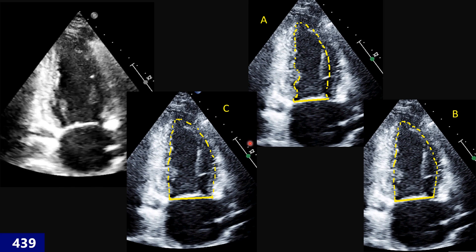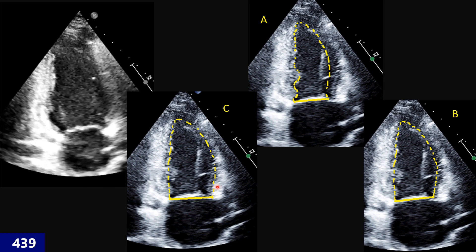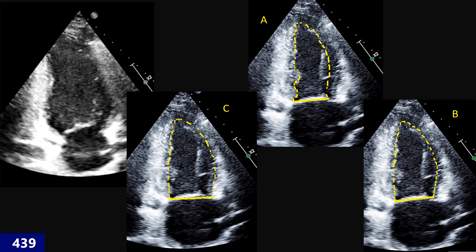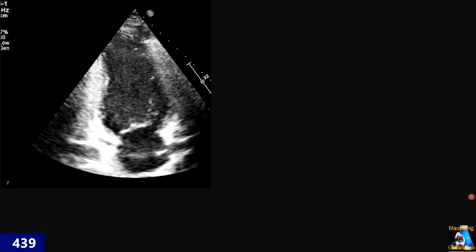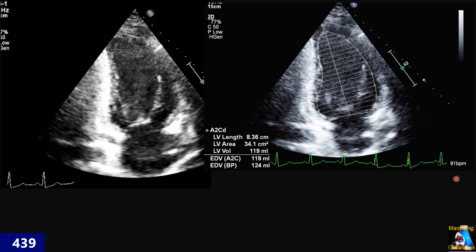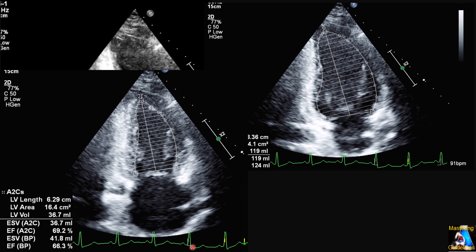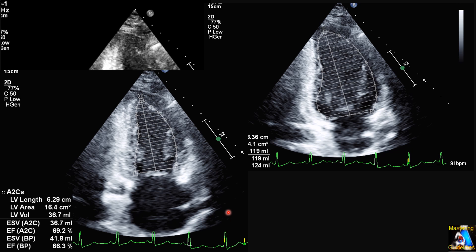The criteria for selecting the correct tracing for Simpson's method in systole — the same concept applies in diastole. Here, take this tracing at end-diastole and this one at end-systole. Is that correct tracing at end-diastole and end-systole? If not, where is the mistake?